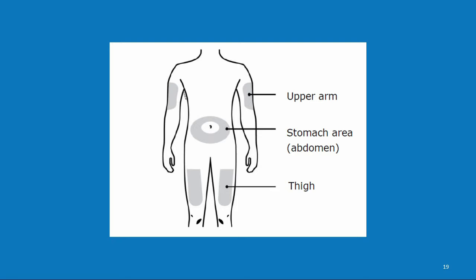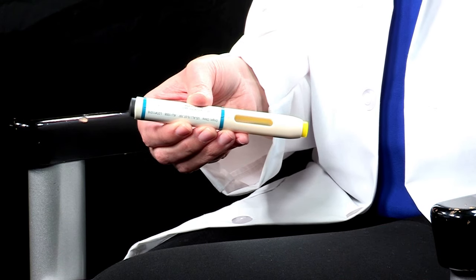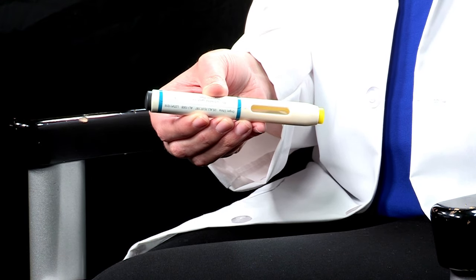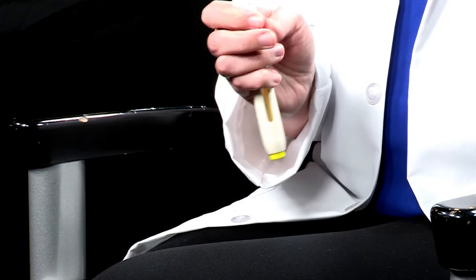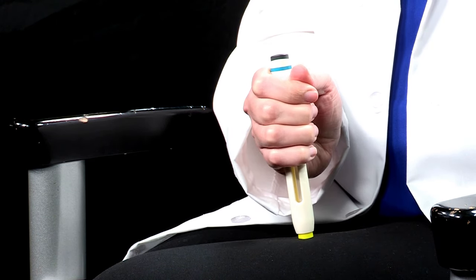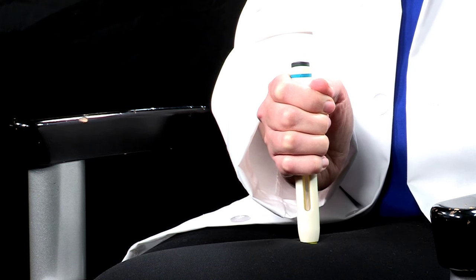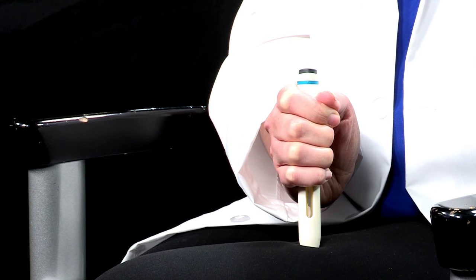Now you are prepared to give yourself the Alirocumab injection. When you are ready to inject, pull the blue cap straight off. Do not put the blue cap back on. Do not touch the yellow safety cover because the needle is hidden inside. Make sure you can see the medication window. With the blue cap off, put the yellow safety guard end straight onto your bare skin at a 90 degree angle. Do not touch the green or gray activation button yet. Firmly push the Alirocumab autoinjector straight onto your bare skin until the autoinjector stops moving and the yellow safety cover is no longer visible. The autoinjector will not work if the yellow safety cover is not fully depressed.